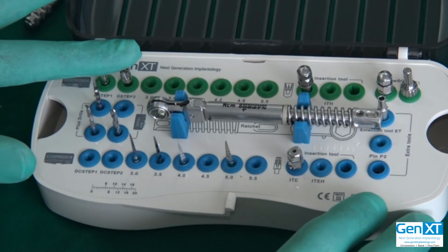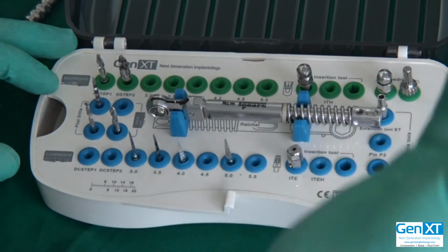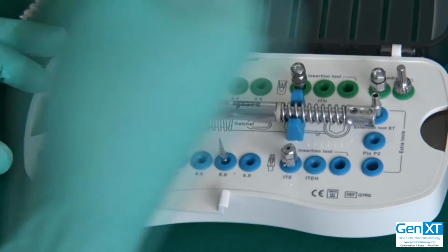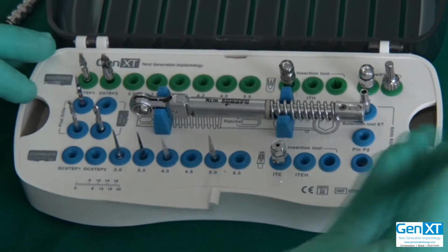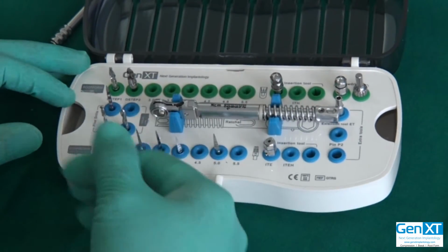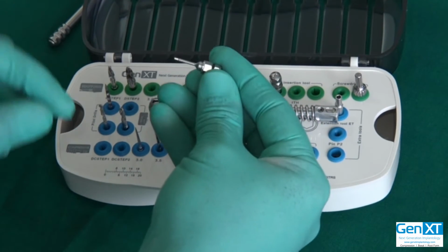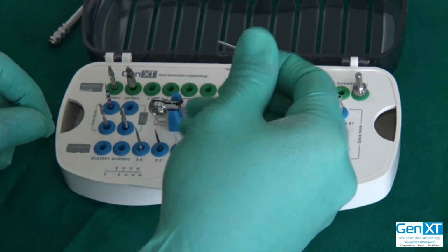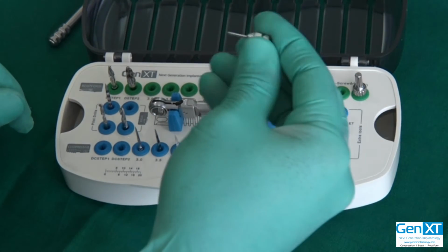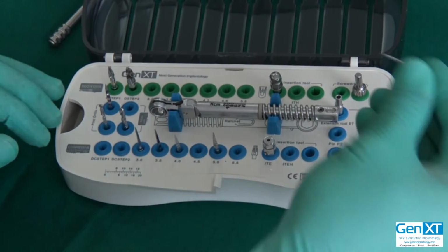Once you have made the drilling, then you can take the implant in the green holder, insert it with your hand. Once you insert the implant with your hand, you take the green holder out. I would advise you straight away you should take out the abutment. So you use the SDL, it is a hex driver. You put it in, you unscrew it as you saw yesterday, and then you take it out completely until it exits the body of the abutment also.